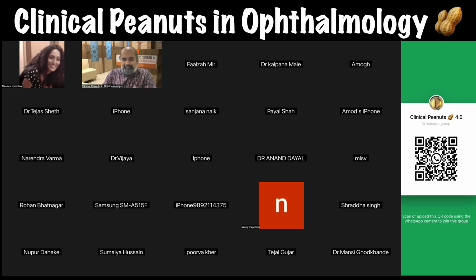I have not used the Rayner Toric, though it's available in a much wider range. I know that for extremes, some people do use the Rayner Toric. It's quite a good lens. Also, I think the haptics are different. One has plate haptics, one has those C-shaped haptics, and whether those contribute to stability or not, Zeiss comes with plate haptic lenses. Again, I don't have much experience with those companies' toric lenses. But between Alcon and Technis, I might not interchange them.